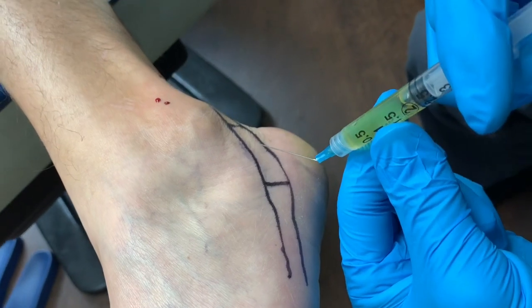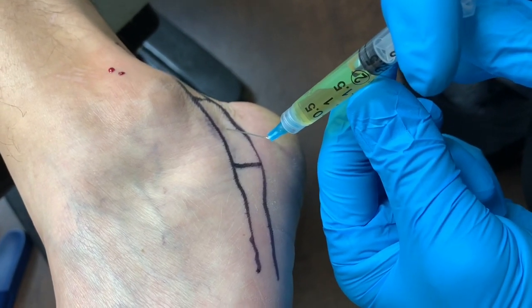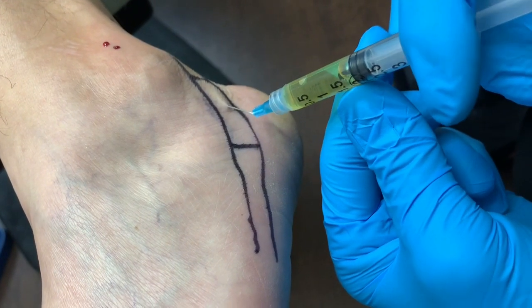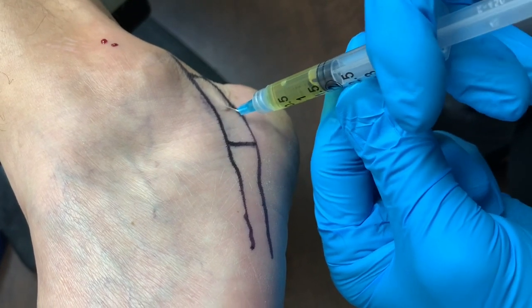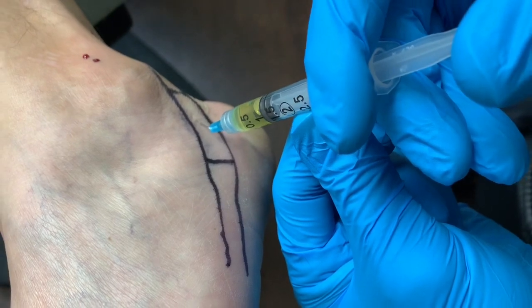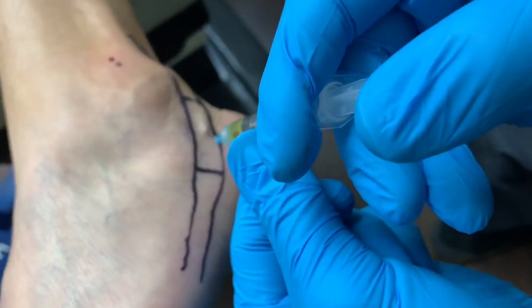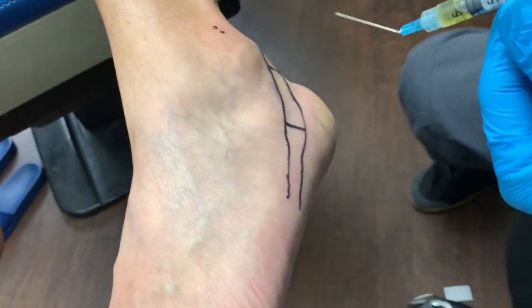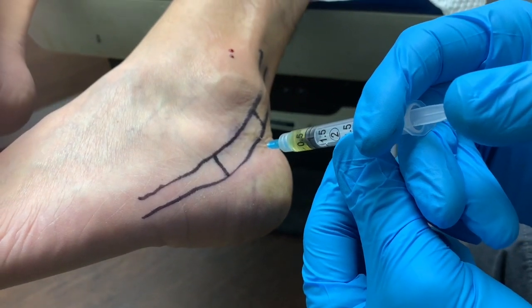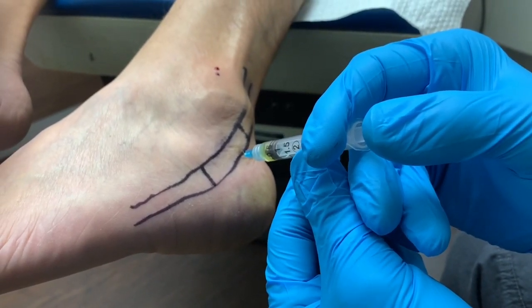We've isolated quite a bit. This should be numb — yes? Okay. What I'm doing is a peppering technique, similar to the micro-tenotomy, where we basically just take a needle and poke at it. I'm just using the tip. I'm basically just poking right there — I'm not jamming the needle deep. Okay, so let's go this way.